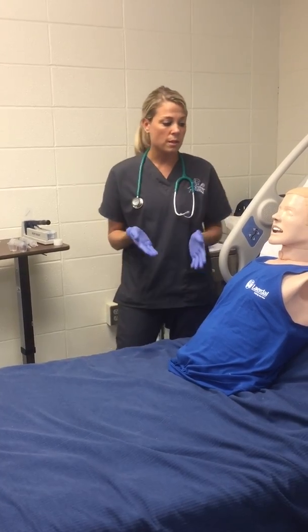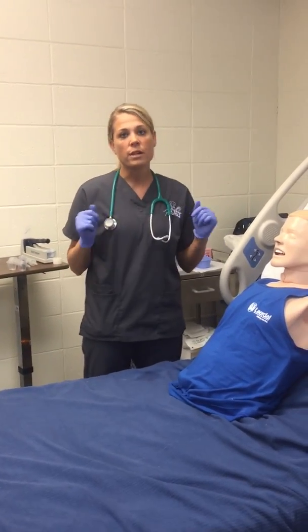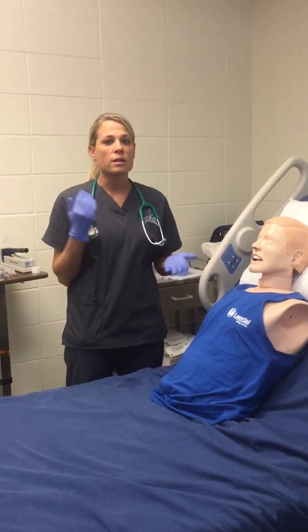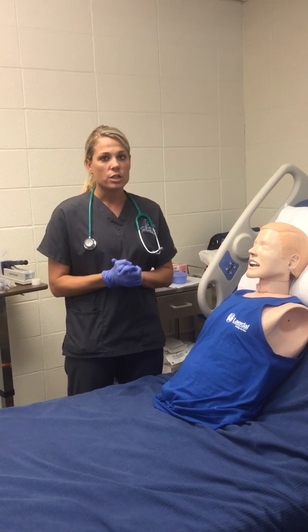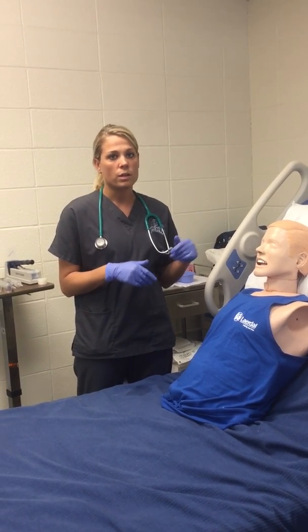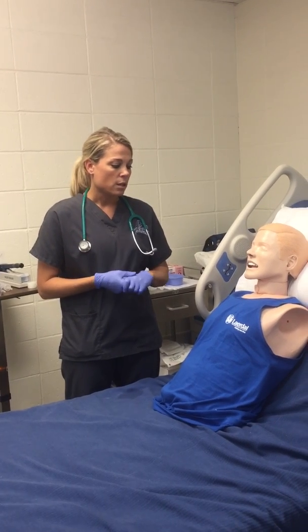So once the tube is out, I would check to make sure my patient is doing okay. I would give him a Kleenex if he needed to blow his nose or anything like that. I would document any relevant data, such as any type of secretions, what is in the suction container, if it was hooked up to suction, and all of that.